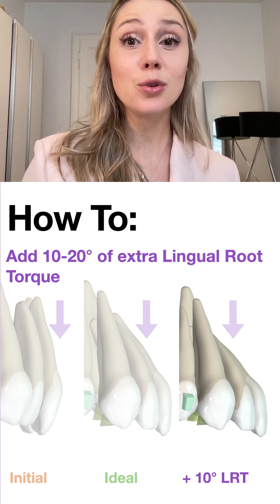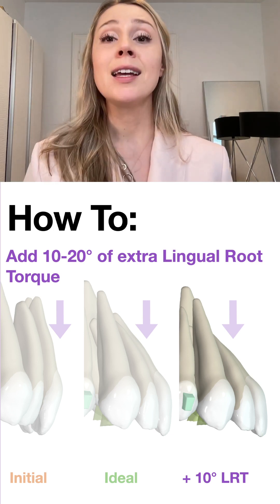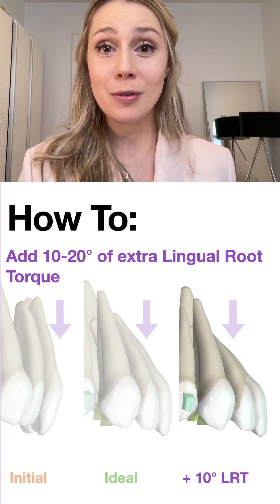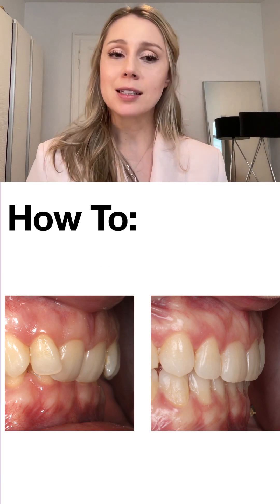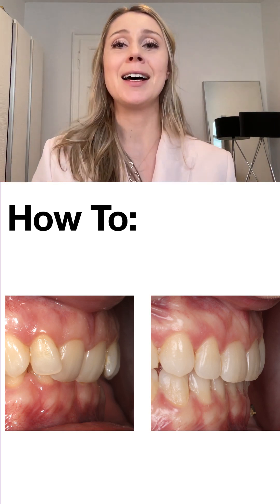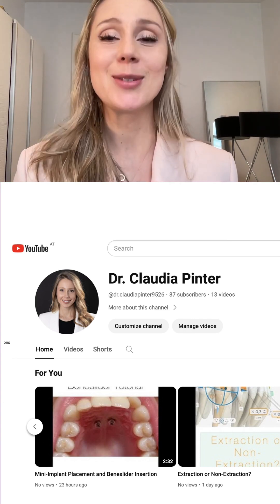I would not go beyond 20 degrees of extra lingual root torque — if you do crazy overcorrections, things tend to get out of control. If you need more, plan your 10 to 20 degrees, then do a refinement and add more. Don't try to solve everything in one set of aligners — it's likely to fail. Here is another example still in treatment, but the change in torque is remarkable: it's not just crown proclination because there's no excessive overjet — this is lingual root torque performed with aligners.